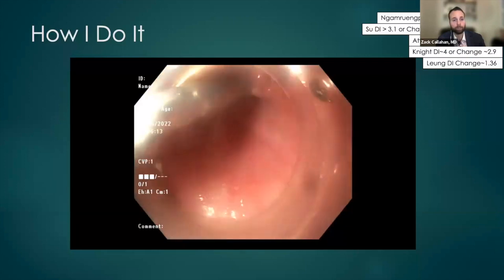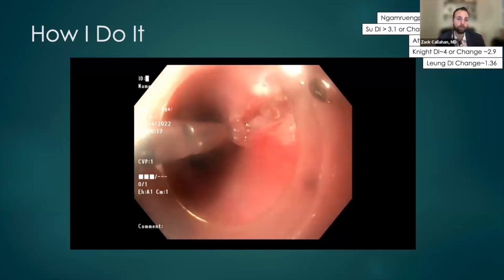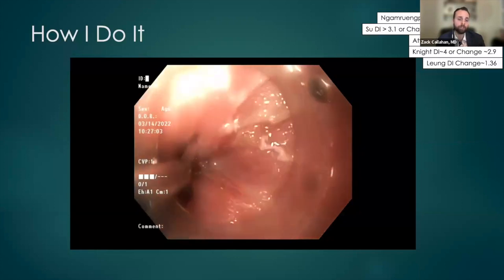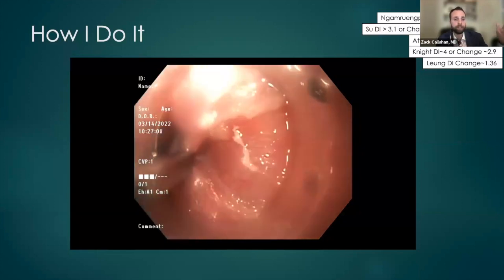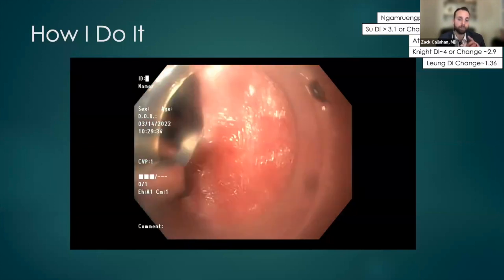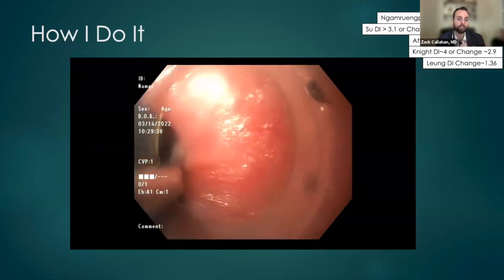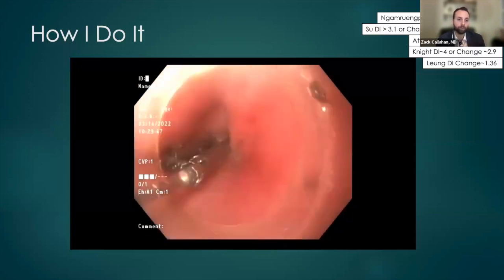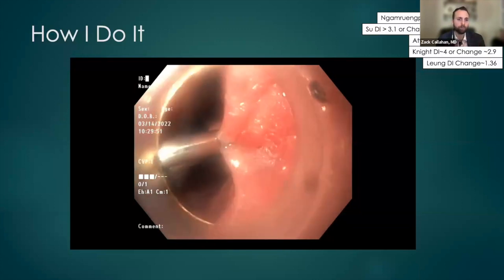I like to clip close the mucosa. I like to go distal to proximal. I find that if you do this first clip well, a lot of times you can just get your cap underneath that, and that'll tent things up. And I also think the most important clip is the one most proximally. If you don't really have that hole well sealed, I think that's where leaks happen. And you can usually get this done with 3 or 4 clips.